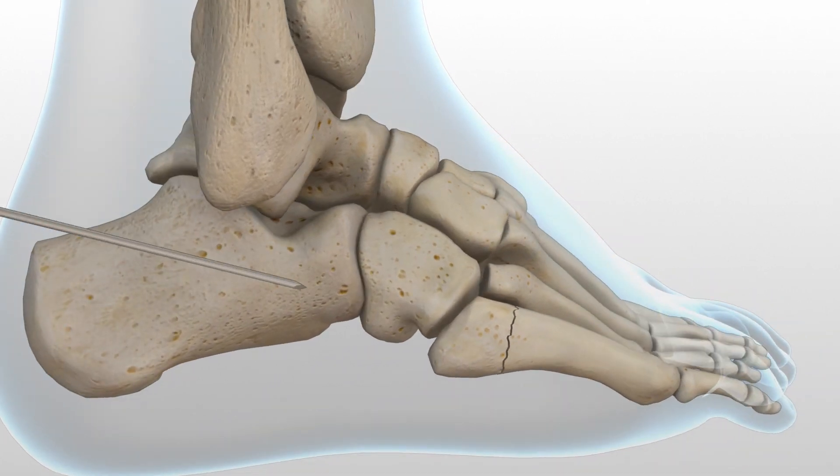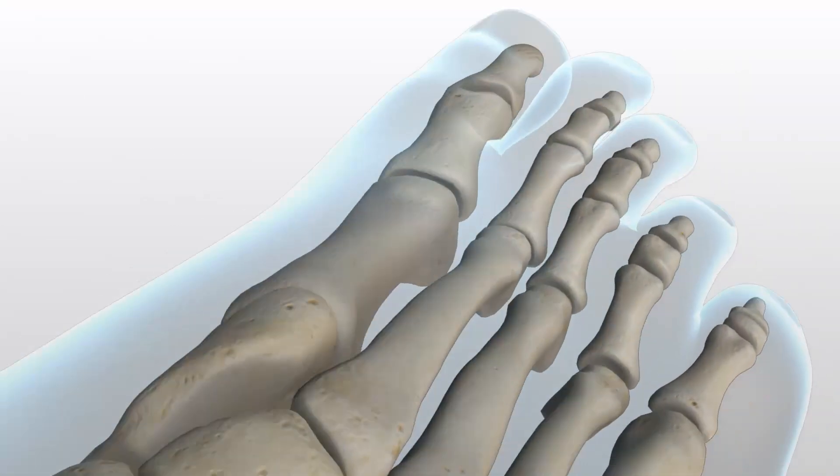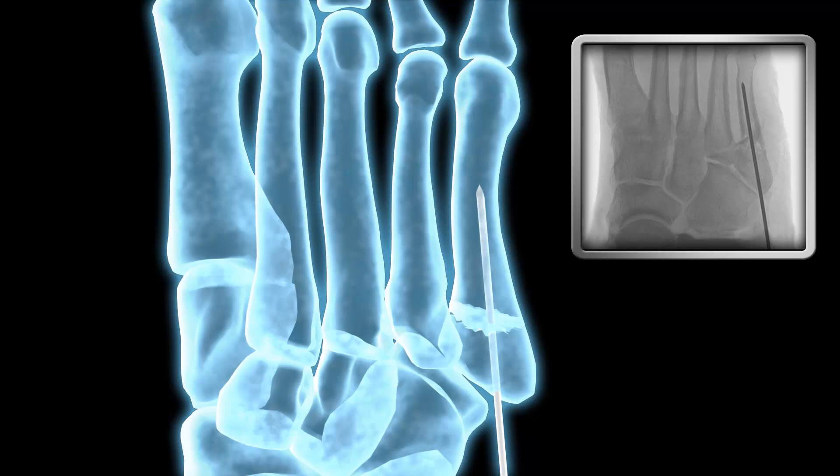An appropriately sized guide wire is inserted from the base of the fifth metatarsal into the central portion of the metatarsal shaft. It is maintained within the intramedullary canal in order to avoid distal penetration. Confirm placement with fluoroscopy. The pin placement can be adjusted as necessary until the optimum position is obtained.